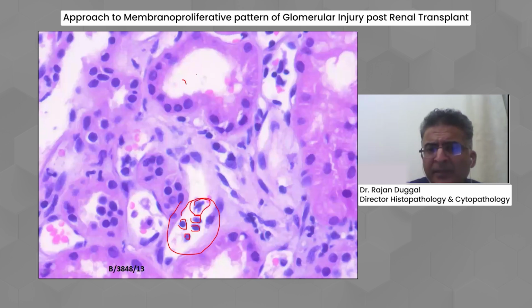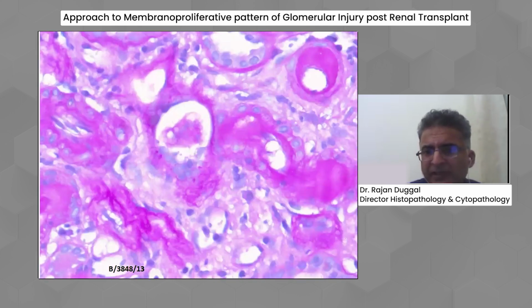This is a proximal tubule. Okay, this is most likely a distal tubule, and you are finding this kind of PTC capillaritis. Okay, so there are some vessels which are showing evidence of hyalinosis also. So this is a small vessel which is showing evidence of hyalinosis with a narrowed lumen. Similarly, this entire thing is a vessel which is showing smooth muscle hyalinosis.